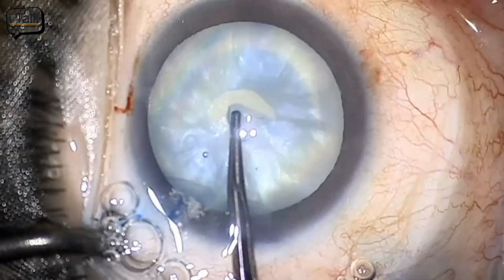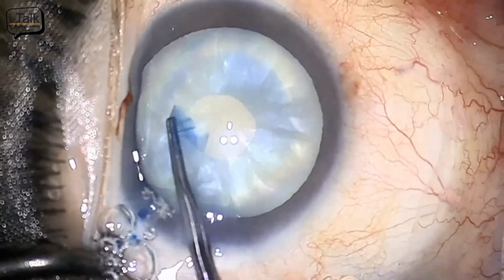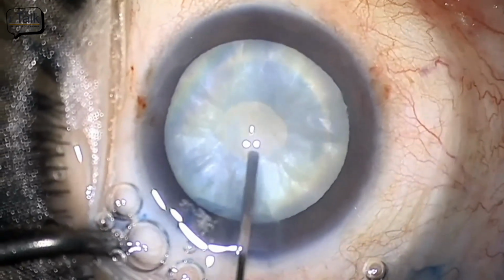So next, I'm not remaining in the center. I'm moving left, right, more towards the opposite side and towards my side, so that I have a small area right in the center which becomes totally concave. As you would see now, once that has been done, the next step is I create a small rhexis, and that is right in that, can you pause it, right in that area. So what I do is I make it right in the center where there is concavity. Now this concave central area is now a very safe area.